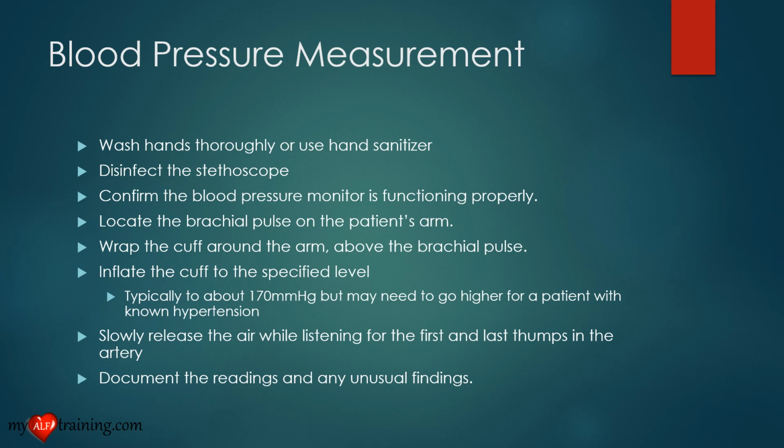We're going to release the air slowly while listening for the first and last thumps in the artery. Afterwards, we're going to document the readings and any unusual findings.